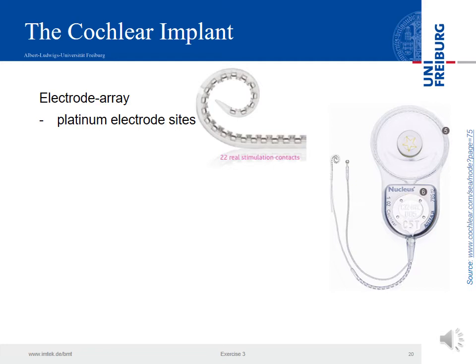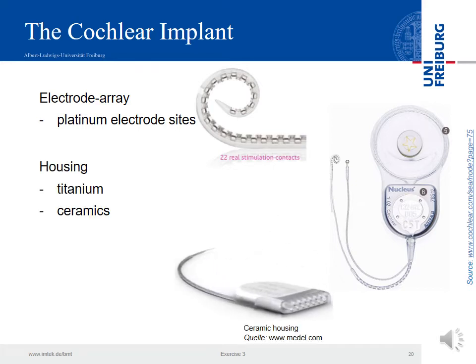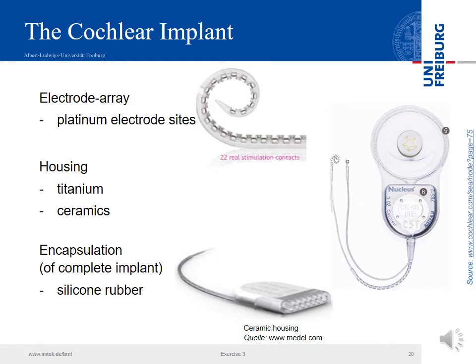Third company is Advanced Bionics, and Oticon, the fourth one, is also around. Encapsulation or overmold is made out of rubber.